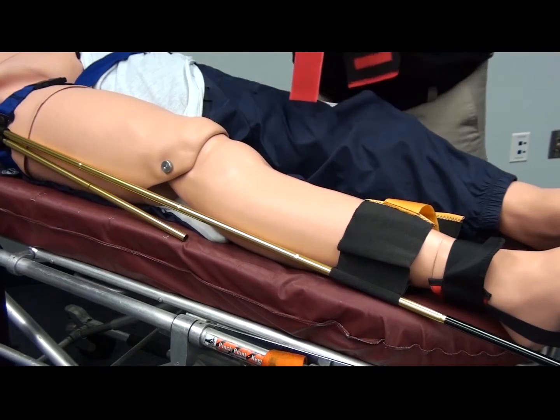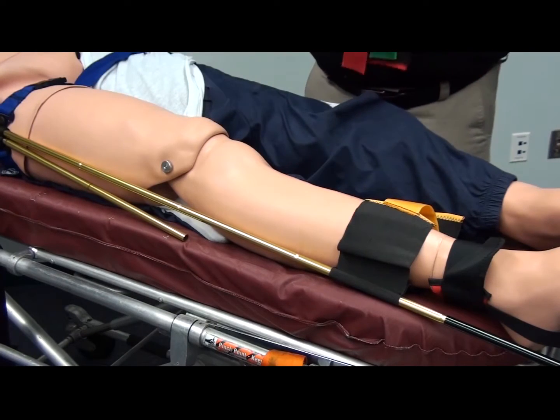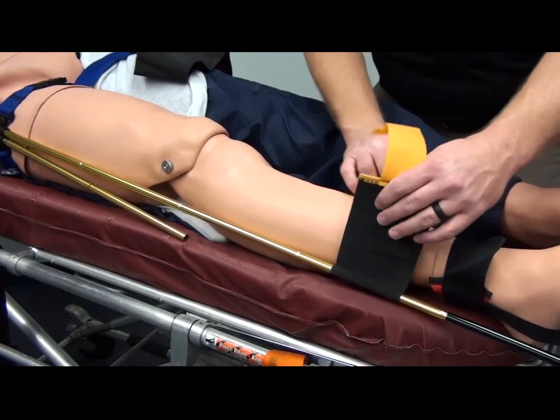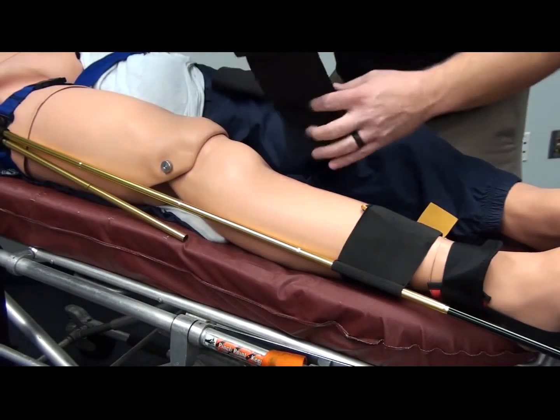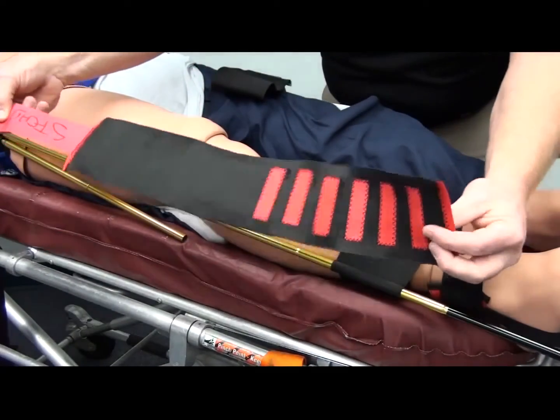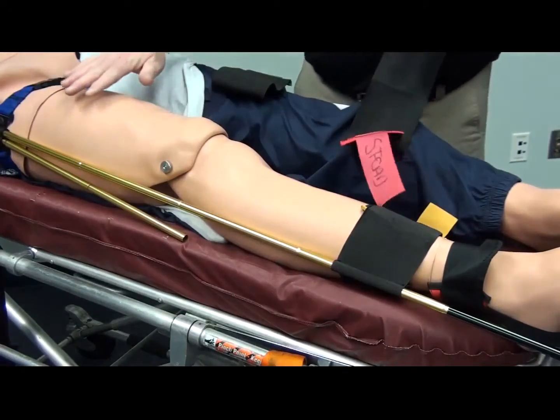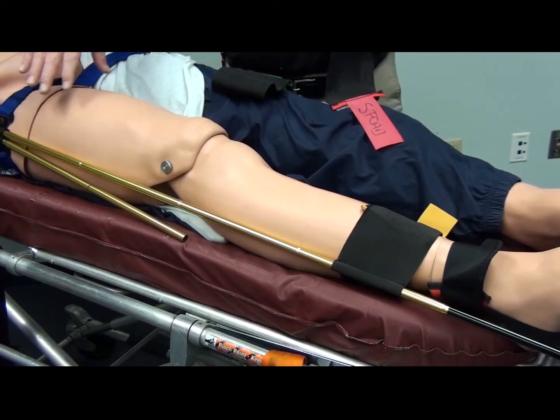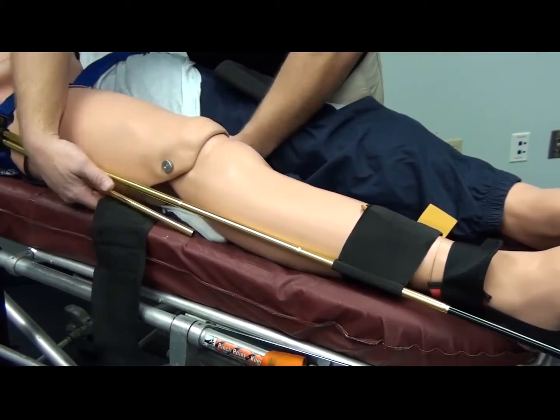Okay, so once you have got the traction pulled, everything's connected the way it's supposed to be. The yellow strap, move it down toward the lower part of the leg. Secure the device that way. Your red strap that you have should go on the upper thigh because it is a lot longer. Again, above and below the injury. So the Ischial strap is high, the mid shaft. Let's go just above the knee with this strap.